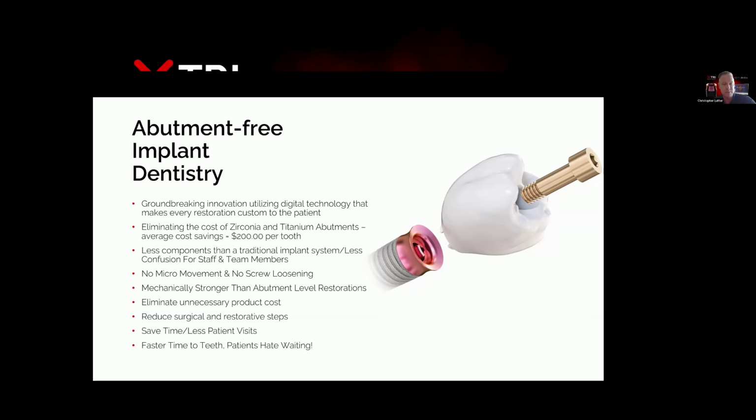I know Dr. Mirelez will certainly comment on that in his presentation, but it's important to know this screw is double the thickness of the current implant screw you worked with today, at 1.4 millimeters to 2.8 millimeters thick. That carries that mechanical load, has more surface area because there is no tie base or MUA, and can be obviously milled right or printed right to the interface.